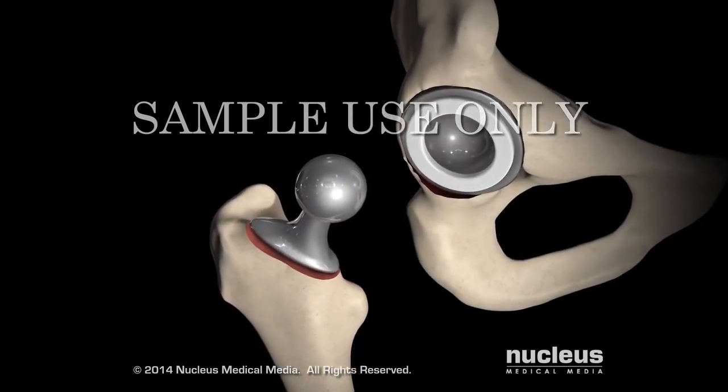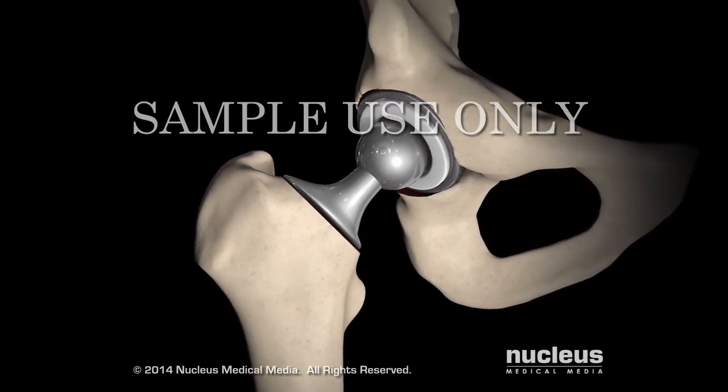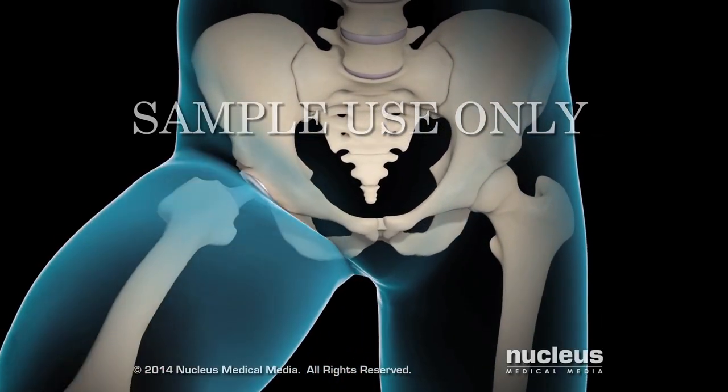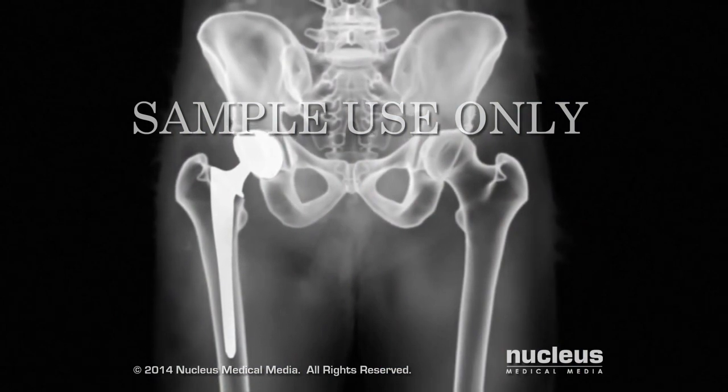Once both components are firmly in place, your surgeon will slide the prosthetic femoral head into its acetabular counterpart, test the movement of your new hip joint, and may verify that it is properly positioned with an x-ray.